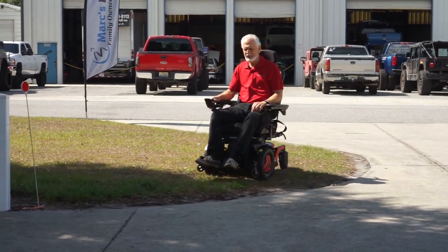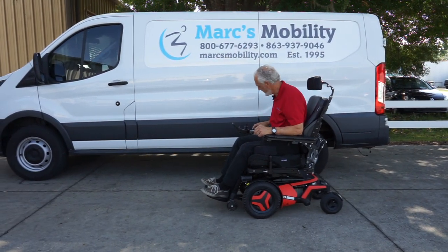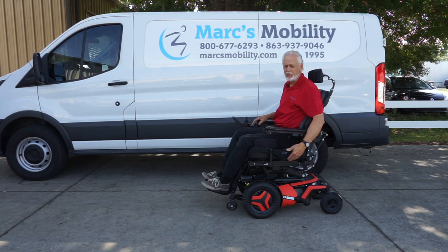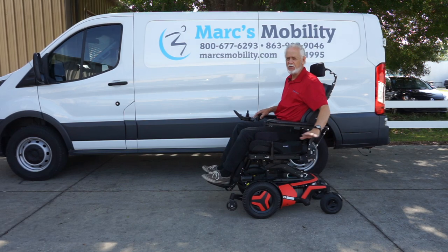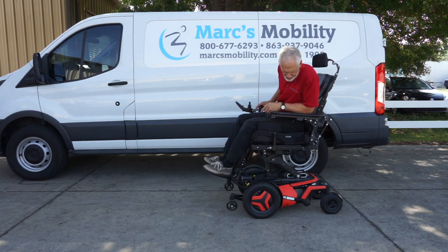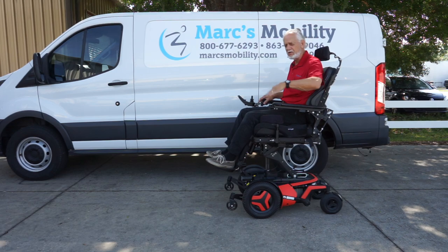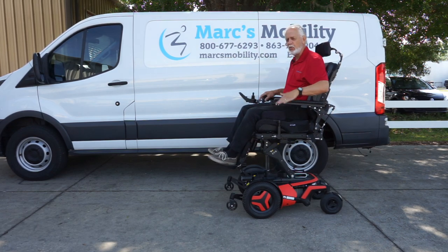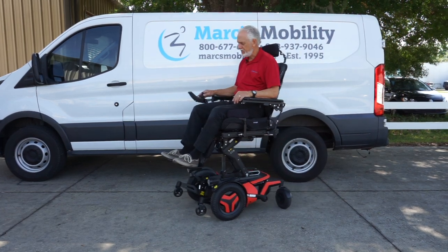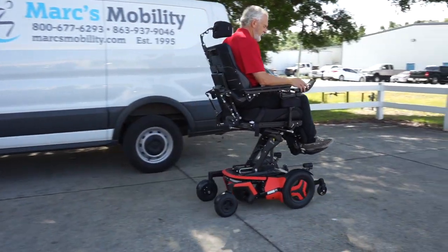This chair will have no problem with grass as long as it's not too deep — it should handle any yard. I'm going to raise the seat so you can see the elevation. If you're going to drive with the seat elevated, do yourself a favor and drive on flat surfaces. I'll show you how well it drives with the seat elevated. Remember, it has seven electrical functions: seat lift, tilt, recline, anterior tilt, legs in and out and up and down, 14-inch seat lift, high-speed motors, and the standing feature.